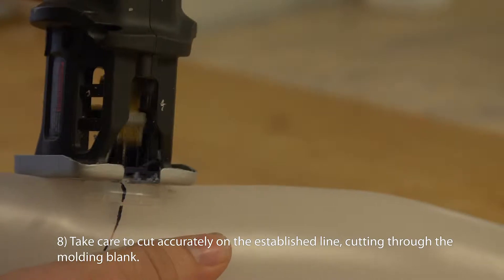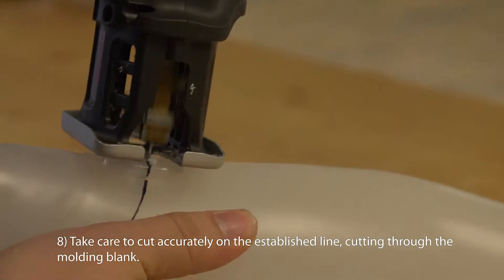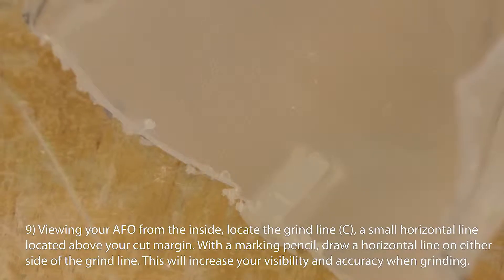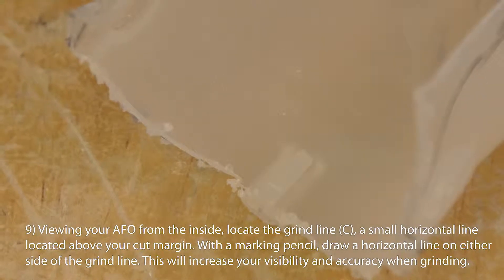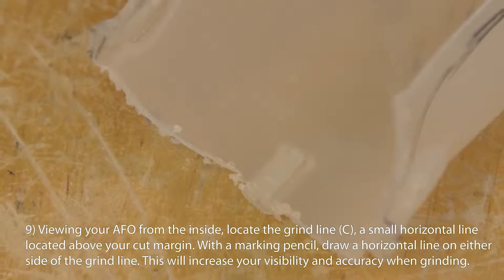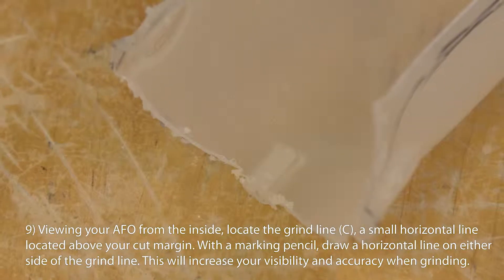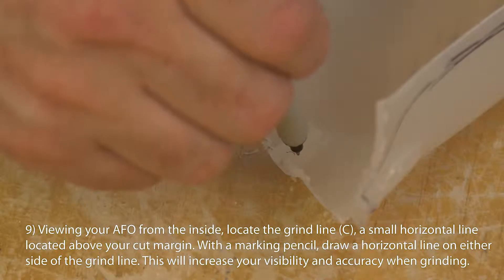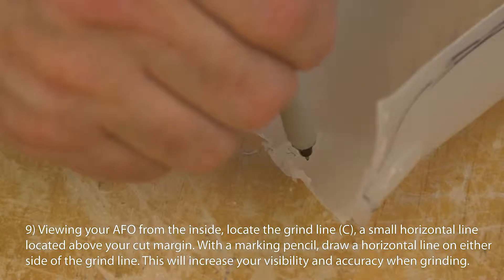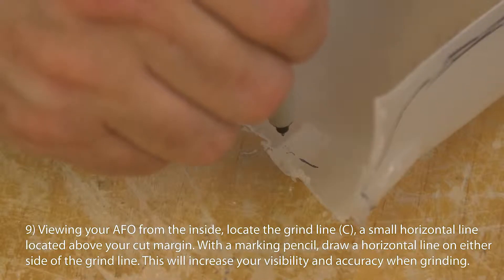Take care to cut accurately on the established line, cutting through the molding blank. Viewing your AFO from the inside, locate the grind line C, a small horizontal line located above your cut margin. With a marking pencil, draw a horizontal line on either side of the grind line. This will increase your visibility and accuracy when grinding.